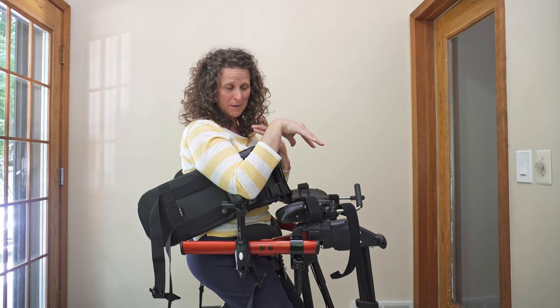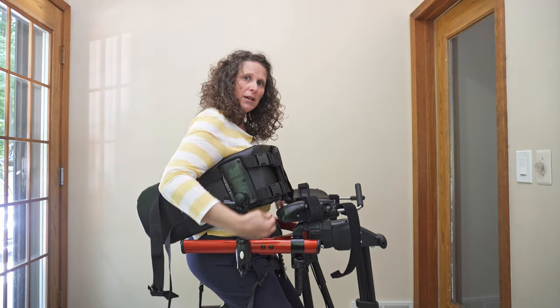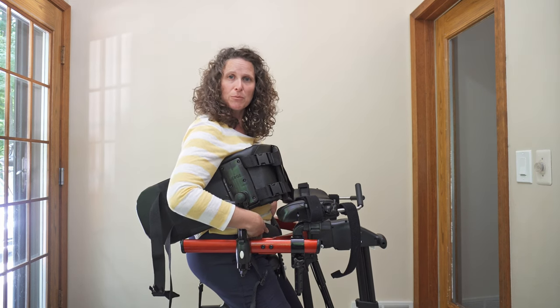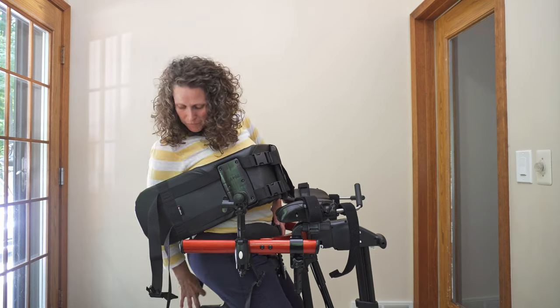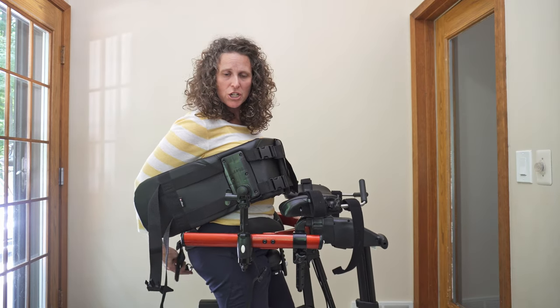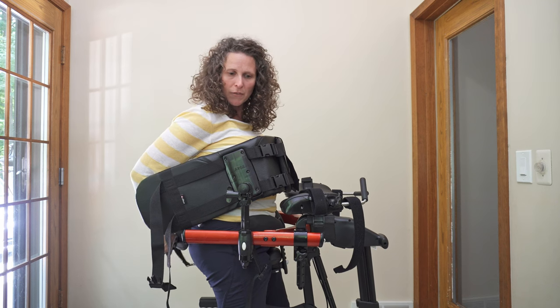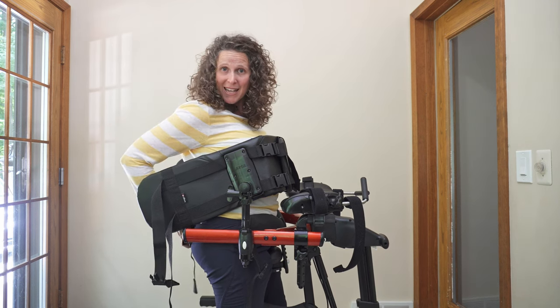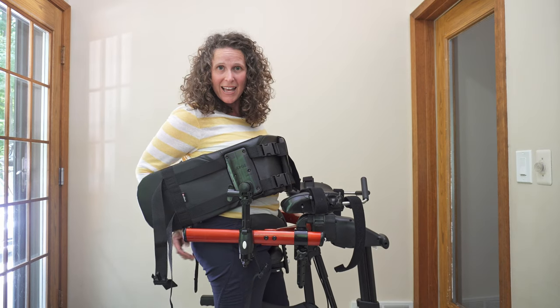Bring their hips forward and be thinking about the hip corral in that position to support them the best. Also be thinking about how this pad behind their pelvis is positioned, so that if they have a pelvic obliquity you're either helping them compensate for that or correcting it — whatever is needed for that individual to be the most functional.